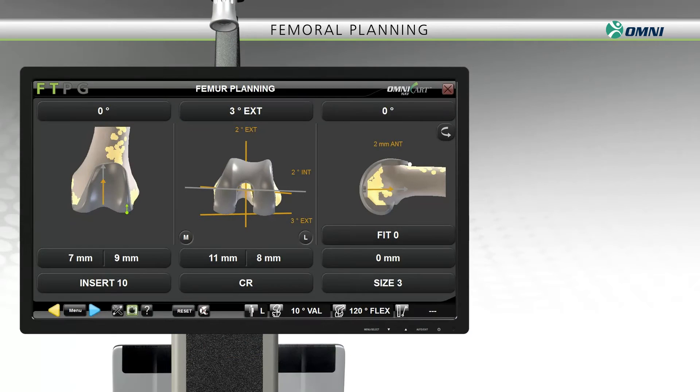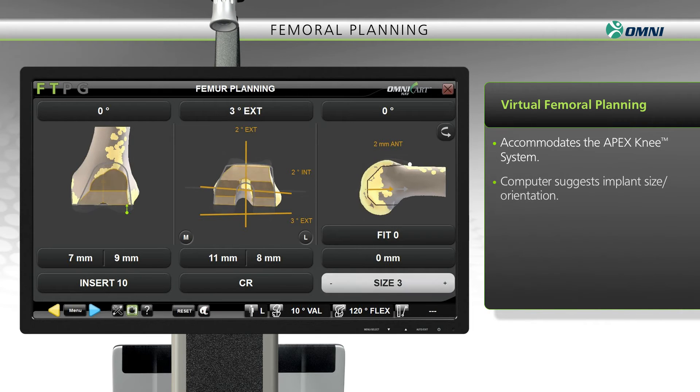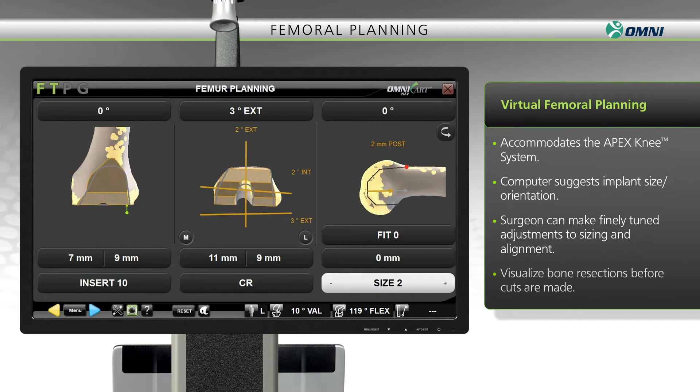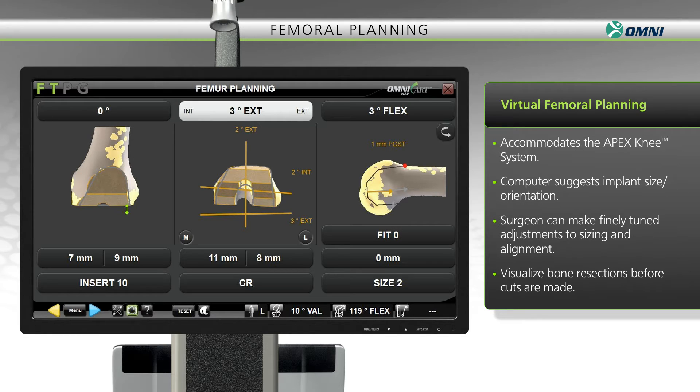Now, let's take a look at how this robotic-assisted system supports femoral planning. The system is designed to accommodate the Apex knee, with all sizes and models pre-programmed into the software. Based on these configurations and your preferences, the system calculates implant sizing and alignment, which you can fine-tune. This enables you to plan and visualize planned bone resections before cuts are made, and this digital plan is used to determine the position of the cutting guides.